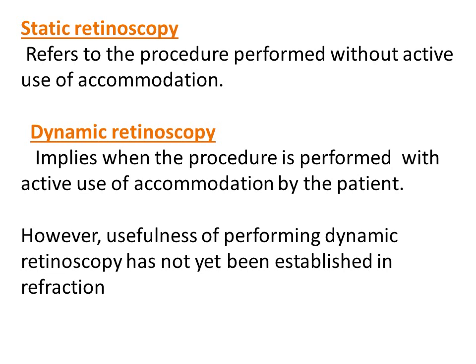Now there are 2 terminologies. One is static retinoscopy and dynamic retinoscopy. Static retinoscopy refers to the procedure performed without active use of accommodation. This is normally done as we have described earlier, that patient should look at a distinct object and then by arresting the accommodation we normally check the power of the spectacle by doing retinoscopy.